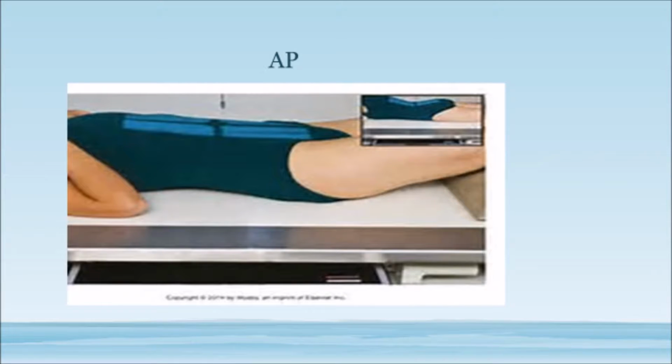For the AP projection, position the patient supine with the arms at the side and head on the pillow. This may also be done upright. The part position is to align the mid-sagittal plane to the CR and midline of the table, flex knees and hips to reduce the lordotic curvature, and ensure no rotation of the thorax or pelvis exists.